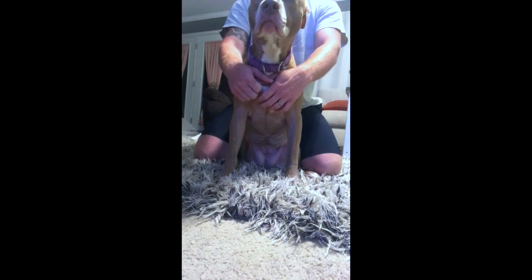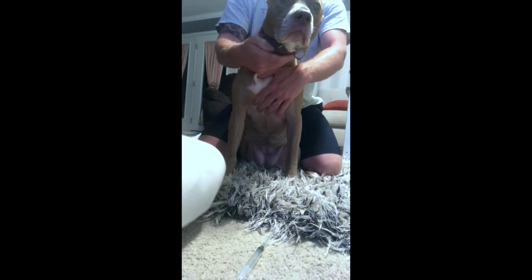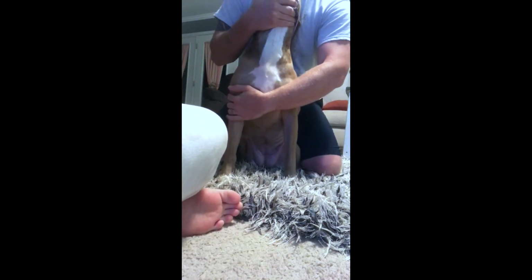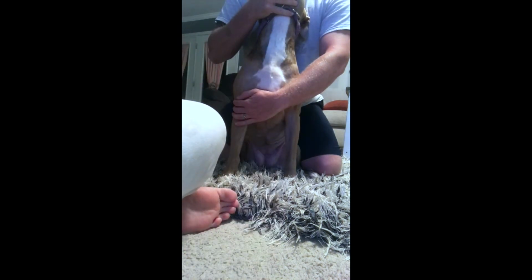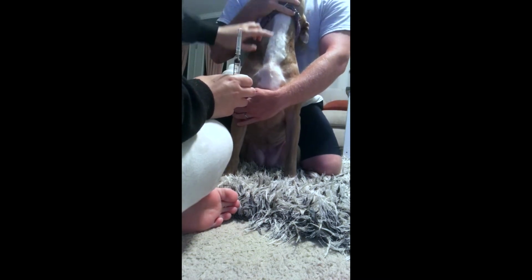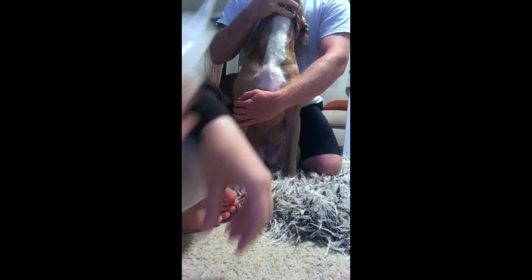Next, I'm going to demonstrate how to do a jugular blood draw on a canine. I have my alcohol here. So you want to keep your patient sitting or laying down sternally. And he has the collar up and the chin straight up. I'm going to apply some alcohol.